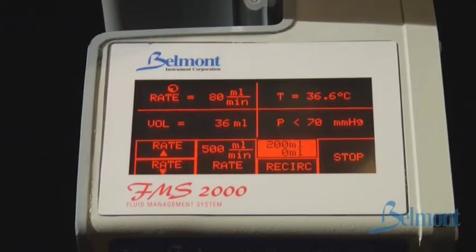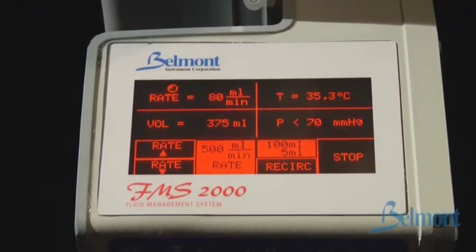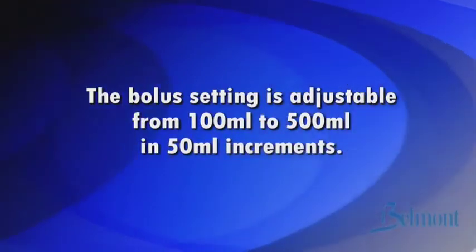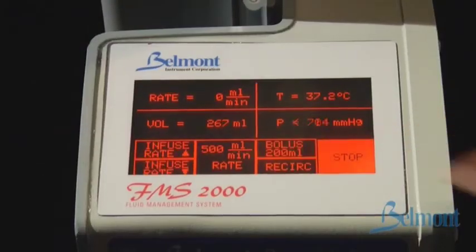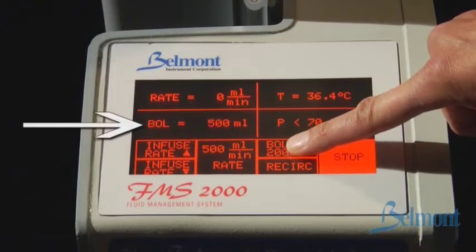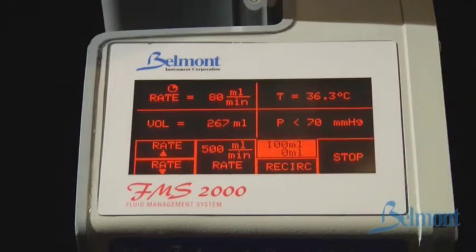Pressing the bolus key will deliver a specific volume of fluid. The volume delivered is displayed on the lower half of the bolus key until the bolus operation is complete. The default infusion rate for the bolus infusion is 200 milliliters per minute. To change the infusion rate, simply press the up arrow to increase or the down arrow to decrease the rate. If you would like the bolus to be delivered at 500 milliliters per minute, simply press the bolus key and then press the 500 milliliter per minute rate key. The bolus setting is adjustable from 100 milliliters to 500 milliliters in 50 milliliter increments. To change the bolus setting, press stop and then press and hold the bolus key. The new setting value will be displayed in the volume section of the display screen; release the button when you reach the desired setting.